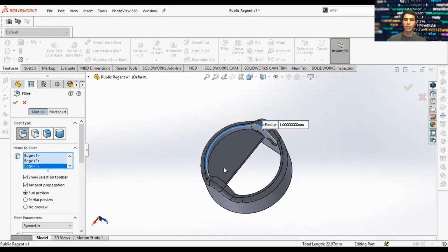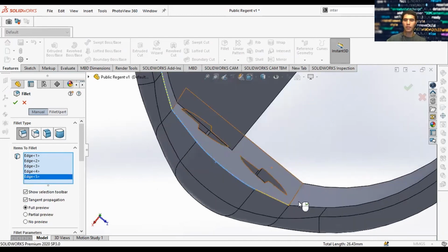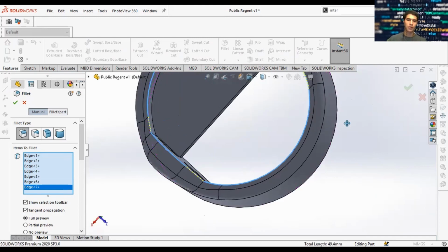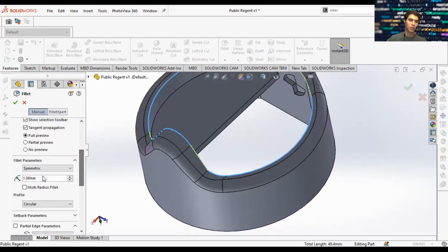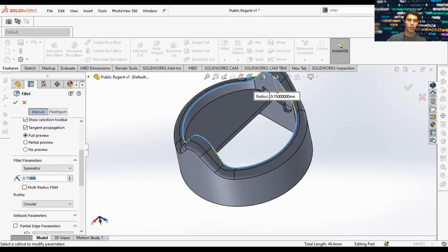Another tip, if the fillet is actually not showing, that means you can't compute it. So for example, all these edges I'm clicking, I'm selecting them, but right now there's no fillet. You can't preview it because it won't be able to compute the fillet. You need to go here and change the fillet size for it to compute. See how it shows now? There's a preview for it because you can compute that fillet. How about this size? It wouldn't work. Can we go higher? 55? 55 works. How about 60? 60 doesn't work.